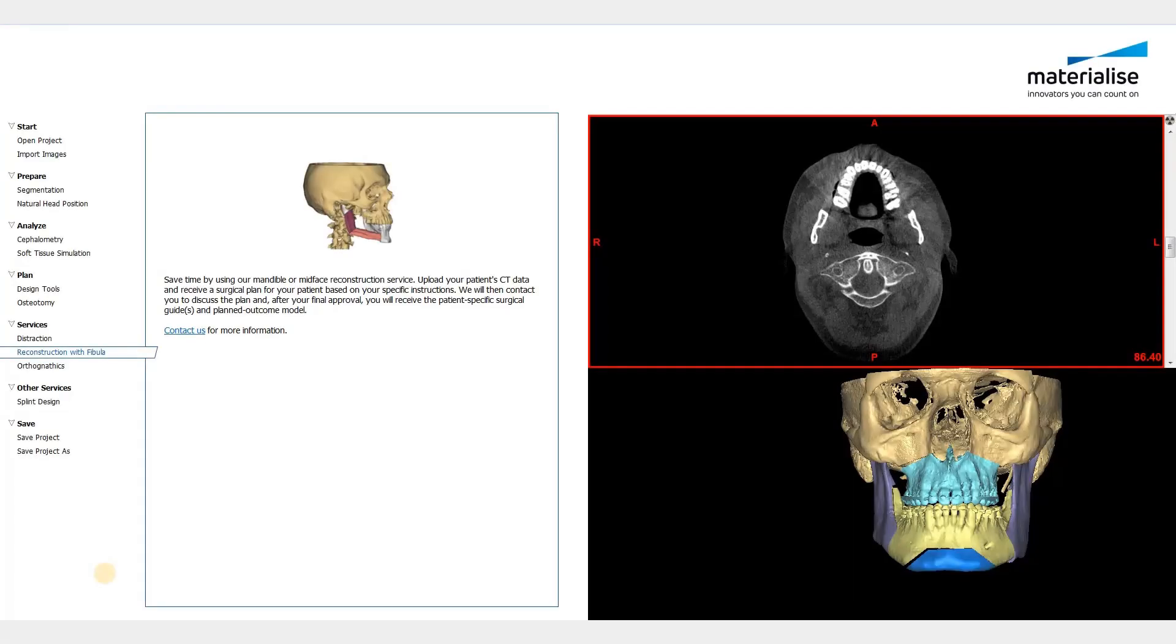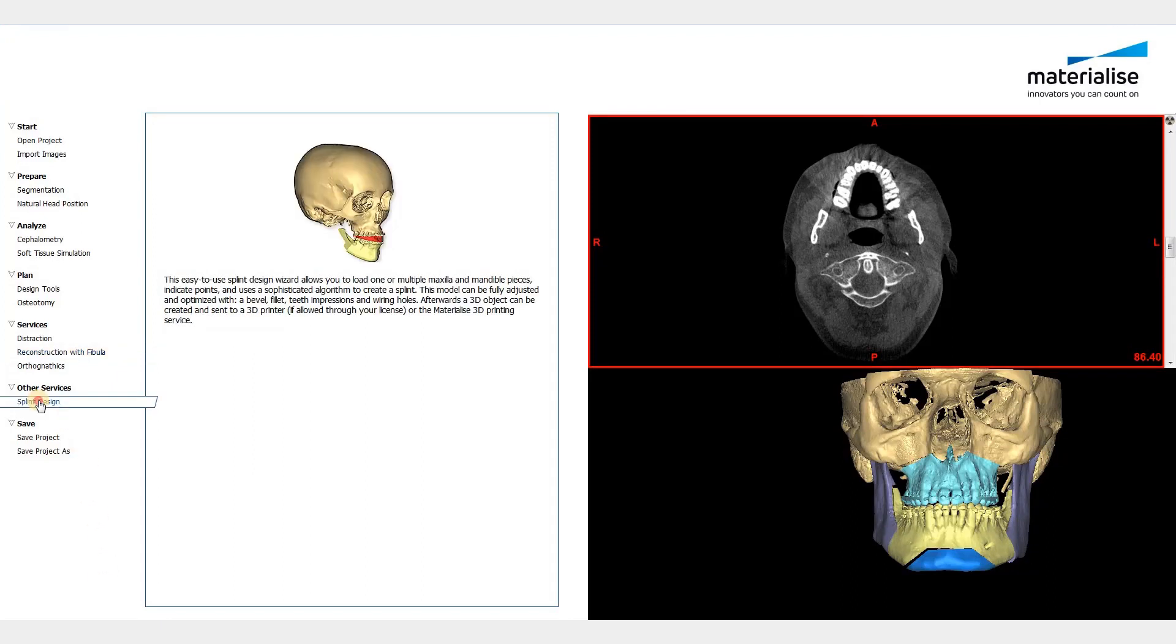Welcome to this ProPlan video. In this video, we will show the five steps to follow when designing splints for your CMF surgeries.